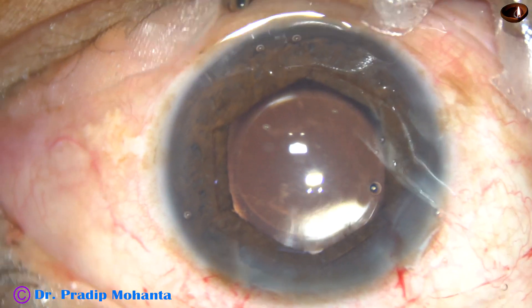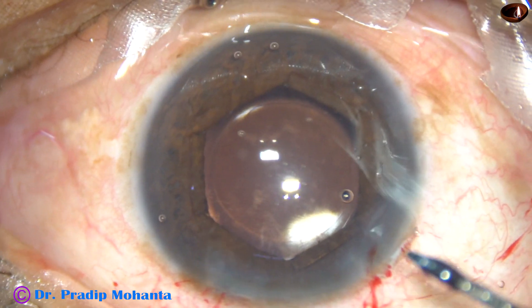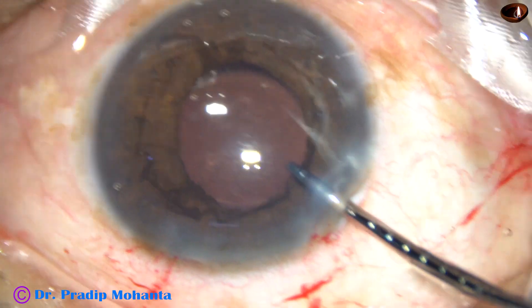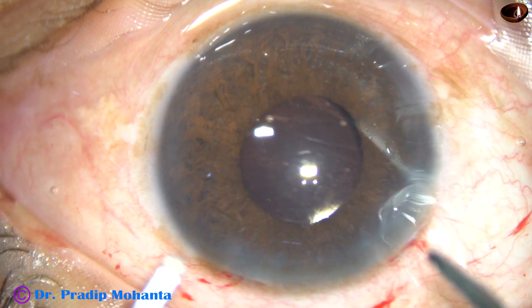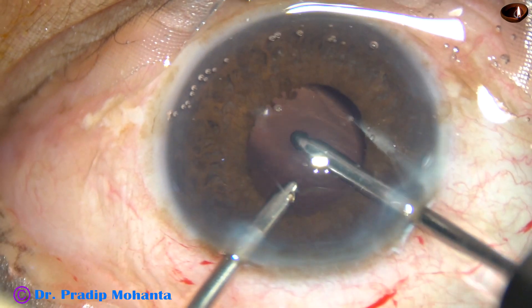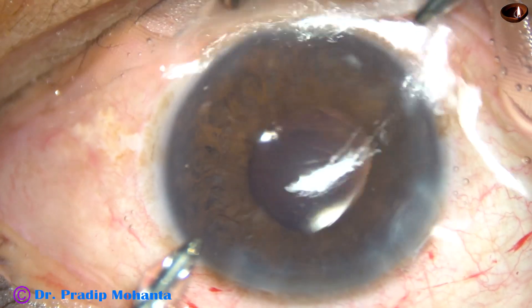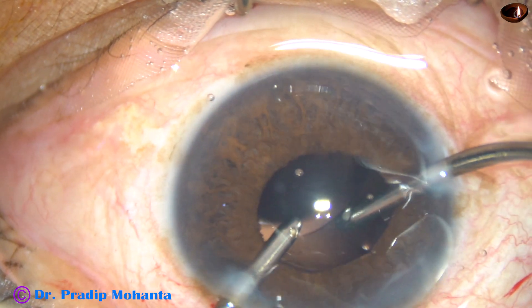Now the lens is dialed a bit so that the haptics are about 90 degrees away from the main incision, so that I can go behind the intraocular lens for cleaning the Viscoelastic substance. And now I am removing the B-hex — first untuck all the flanges and just pull it out. There is no need for an injector with this B-hex pupil expansion device. Now thorough cleaning of Viscoelastic is done.